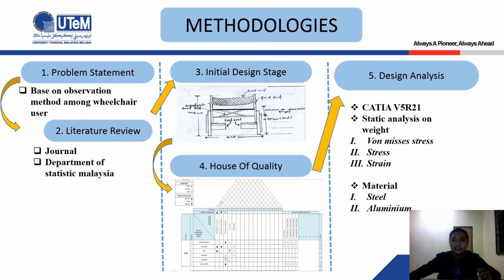Next slide is chapter 3, which is methodologies. First, I have the problem statement. Next, I have the literature review followed by the initial design stage. Then I have the house of quality to determine the best design based on the design concepts, and lastly design analysis.